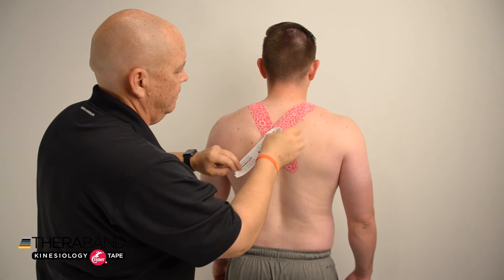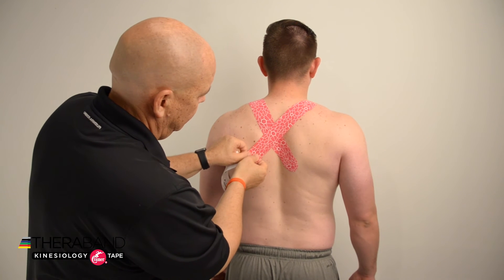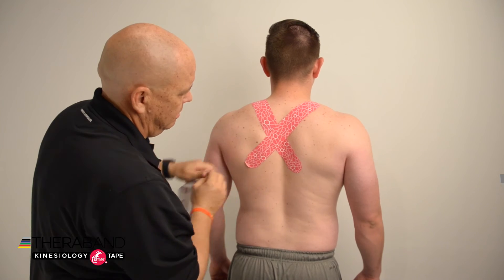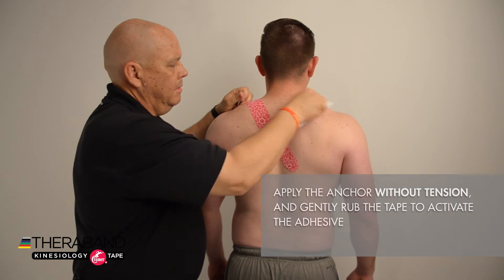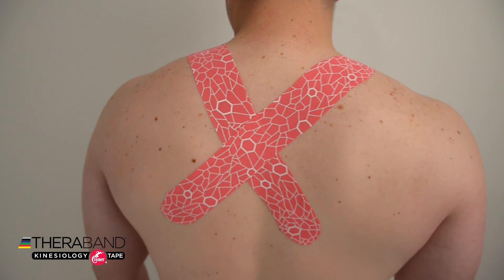Bring the tape down and across to the contralateral side, applying about 25 to 50 percent tension towards the inferior angle of the scapula. Remove the paper backing for that anchor, apply without any tension, and then gently rub the entire tape to activate the adhesive for our postural support taping.